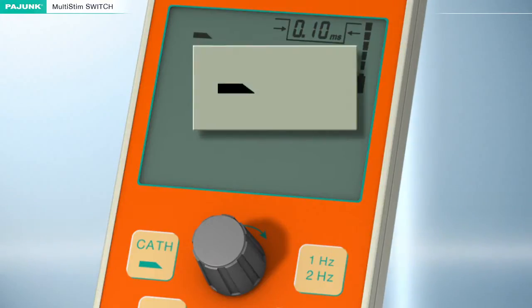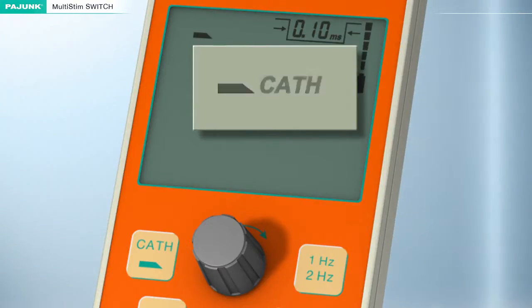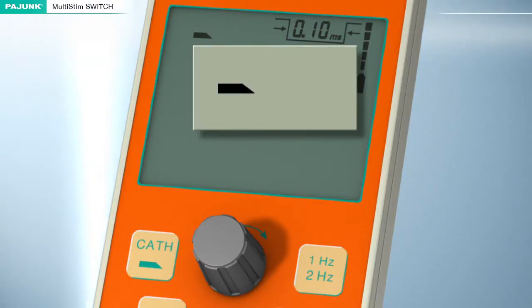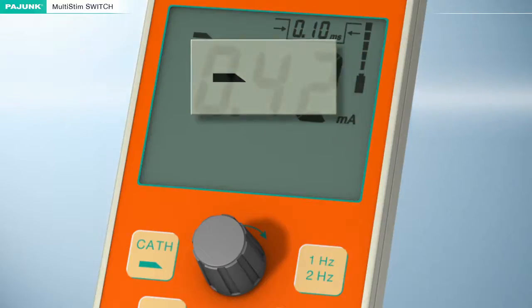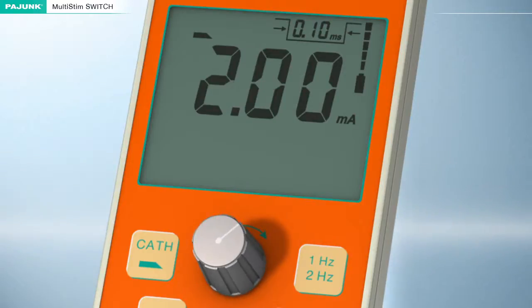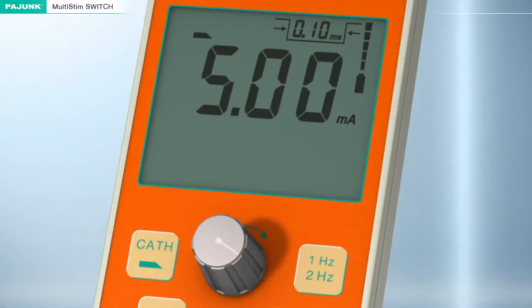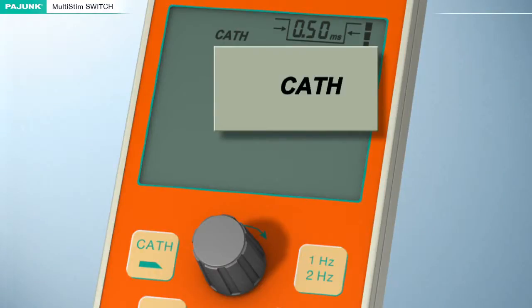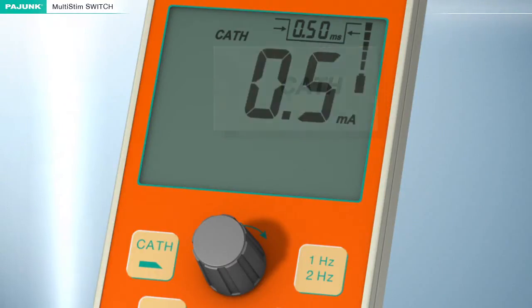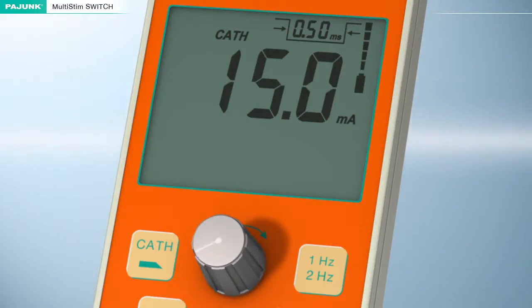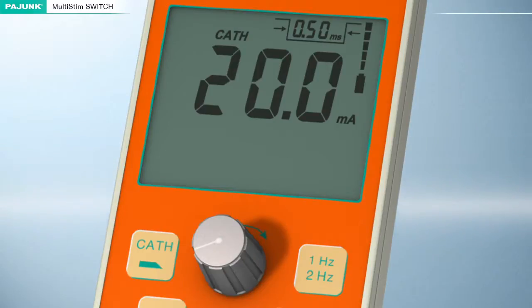This switchover function enables the anesthetist to toggle between the catheter and the cannula. If stimulation by cannula is activated, a needle symbol will appear on the display and the maximum stimulation current intensity will be 6 milliampere. If stimulation by catheter is activated, the word 'cath' will appear on the display and the maximum stimulation current intensity will be increased to 20 milliampere, corresponding with the specific requirements of epidural stimulation.